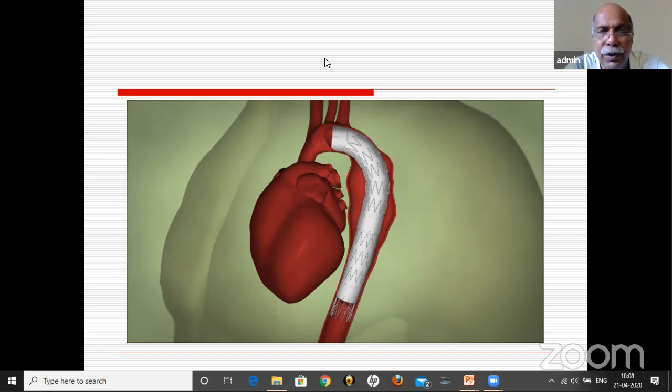There is another question. Hi, sir. Does your choice of distal landing graft change in acute or chronic dissection, say 6 months old? As I understand, the true lumen may not fully expand. I don't think so, because now when you look at all the grafts, they're all nitinol based only. Whatever is the material, the graft expansion is going to be similar. Previously, stainless steel versus nitinol people used to discuss. Now the Cook company is also shifting to nitinol. Other companies are also on nitinol base. More or less it is similar.